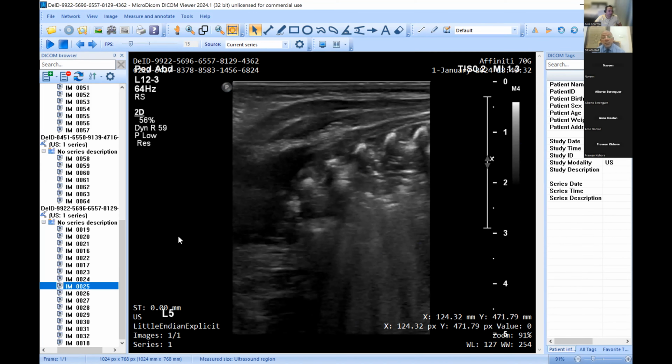My gut feeling looking at the entire image is you've got a massive area of lobar atelectasis. And that's really why I would say, for all of you who've not seen lobar atelectasis, this is a beautiful image, not for the baby, I must say. So basically, that is a thin pleural line. You've got no pleura over here, but this is an entire area of atelectasis.